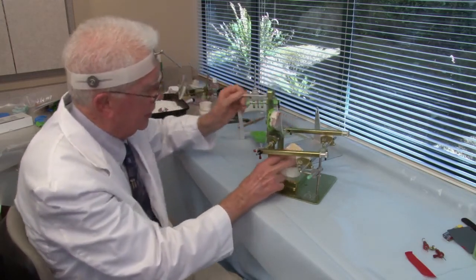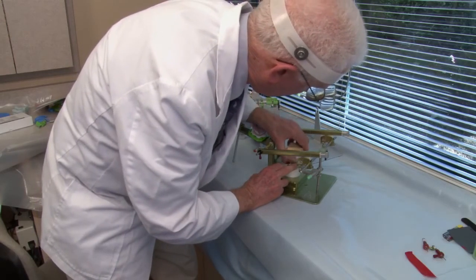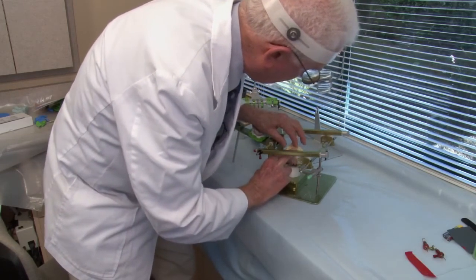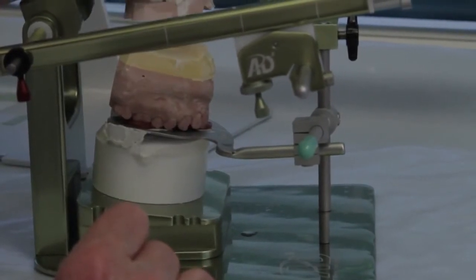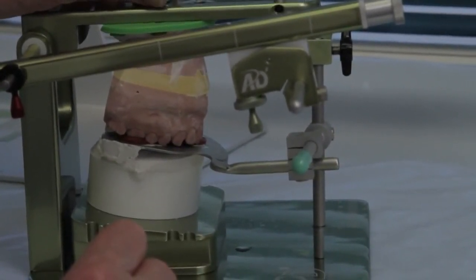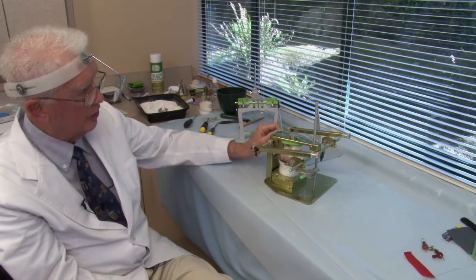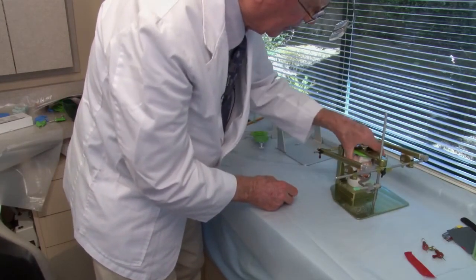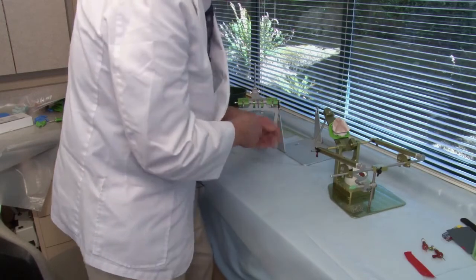I seat the model again, take it out and reseat it in the compound bite. Get it seated exactly in the compound bite, the AccuBites, and then close it down slowly. Close it very slowly and watch, and make sure the upper model doesn't move. And it came together perfectly, no movement of the model. So I split cast check the accuracy of the mounting of the upper model. So it's just a double check procedure that you can do. So now I can take the model out, and I'm going to keep from dropping this, I'm going to take the model off.